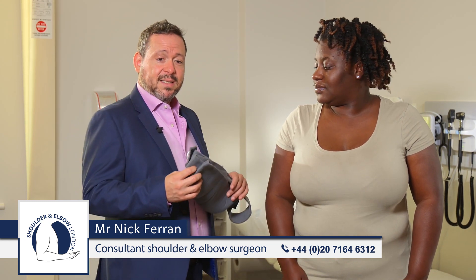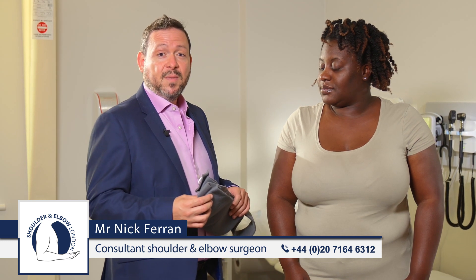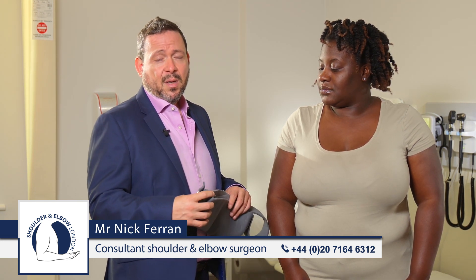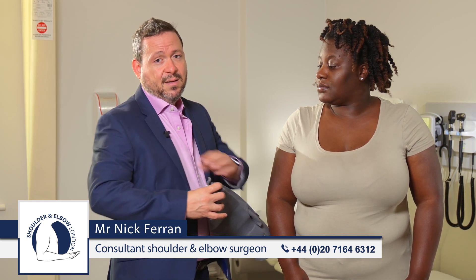It's important that the sling is used as advised by your surgeon and your physiotherapist. It should be worn for most of the day, including sleeping at night, so the arm is controlled and doesn't flop about when you sleep, but can be taken off with care for showering and for cleaning under the arm.